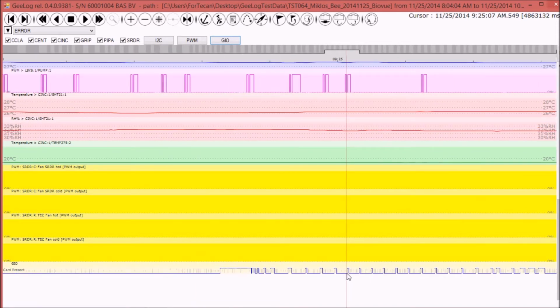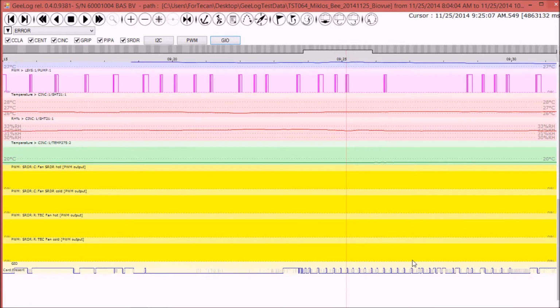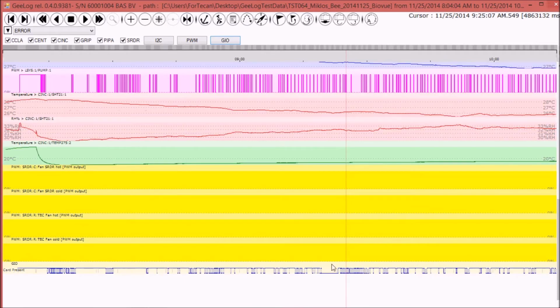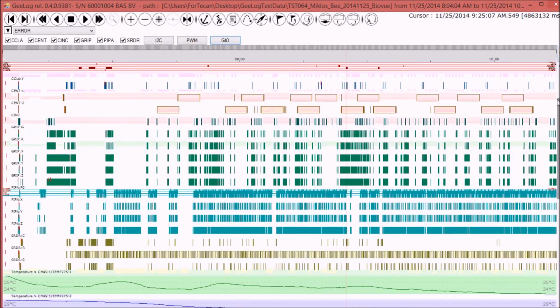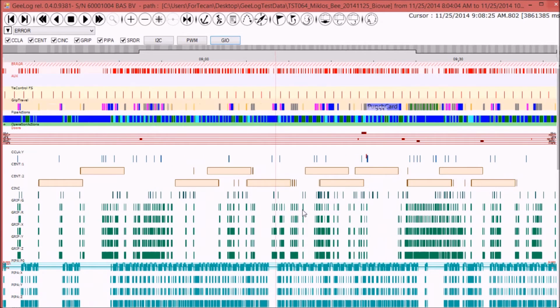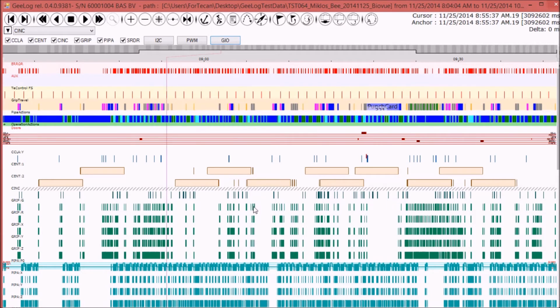The audience of such tool is rather big because it goes from V&V professionals, as I was, to field technicians to development engineers, as you can imagine. Basically, all this kinematic information, all this time-dependent, time-evolving information can be seen both in this timeline metaphor, which can be very useful, but in a way it's limited to professional persons, but also in another, let's call it metaphor, which is that of the real animation.